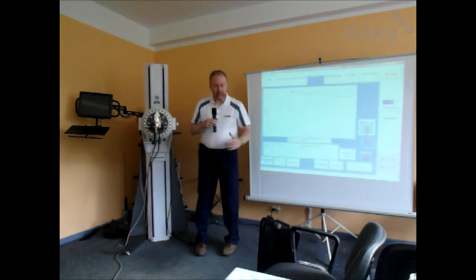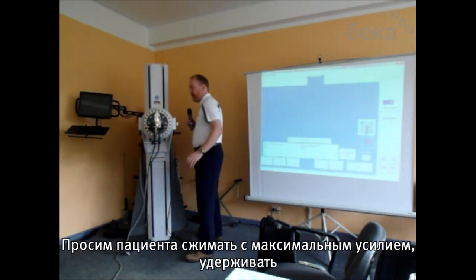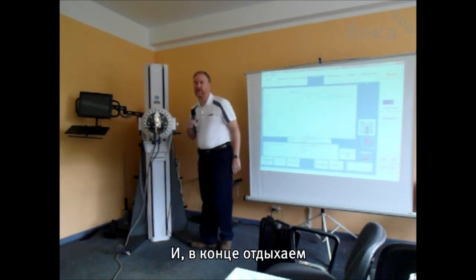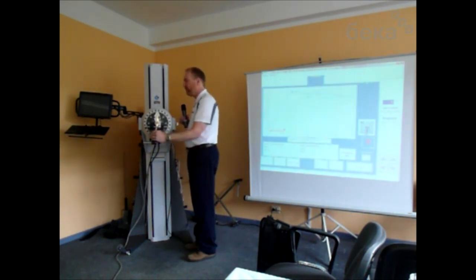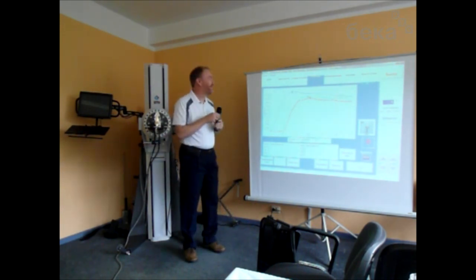Right, so when you're ready to begin the next trial, again, click on Start and instruct the person to begin. Squeeze as hard as they can, hold it, and then at the end, tell them to relax. And do the third trial. Okay. Right. Hard work.